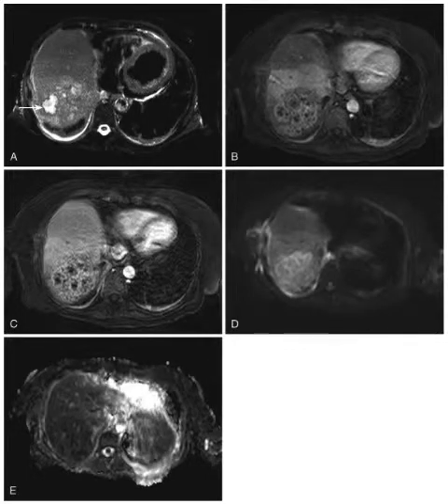Let's talk about some basic characteristics of pyogenic liver abscesses and how we can use these characteristics to help us distinguish this type of abscess from other lesions such as biloma.